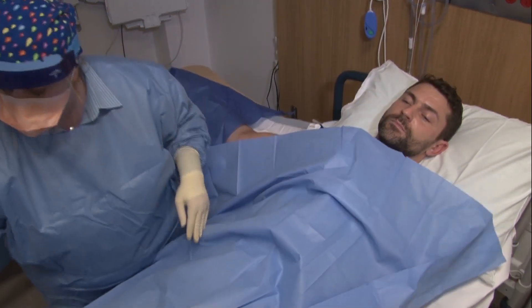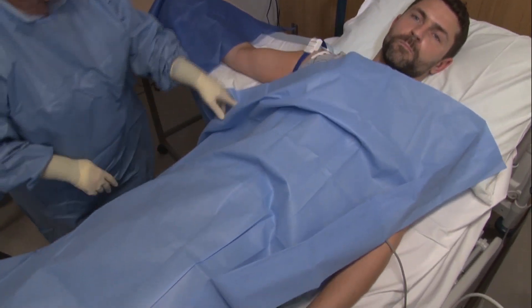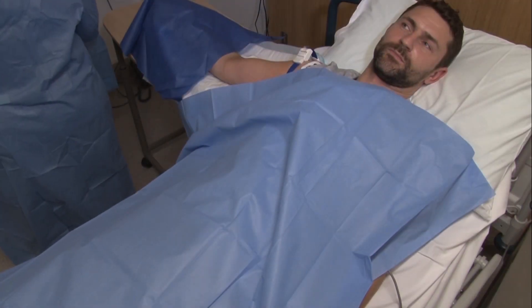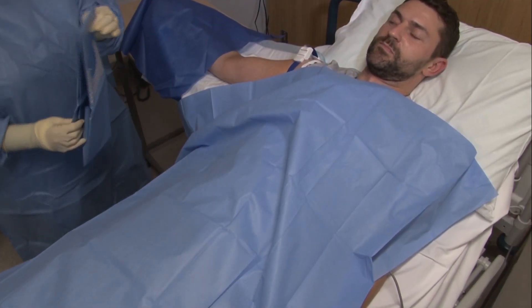Full-length drapes should be applied to provide maximal barrier precautions and ensure proper sterile technique is followed.